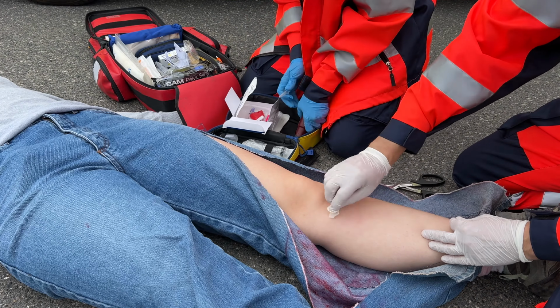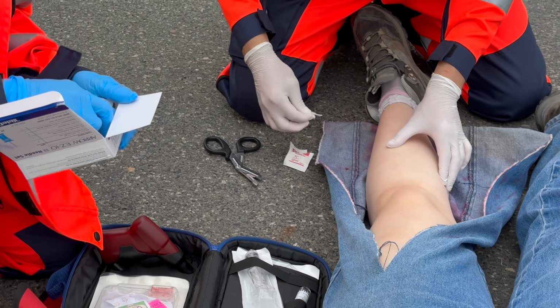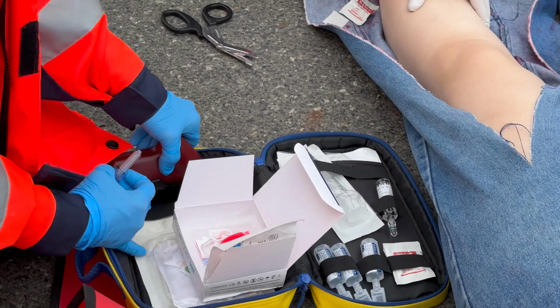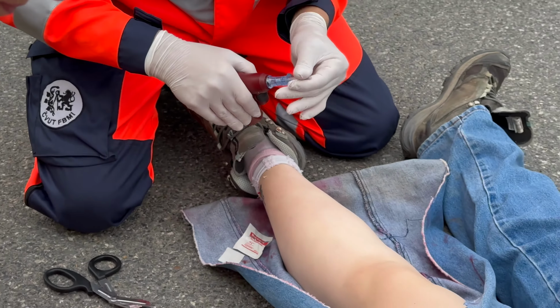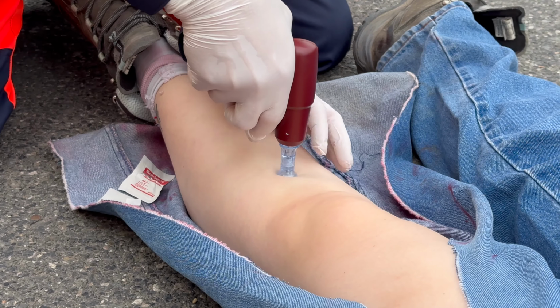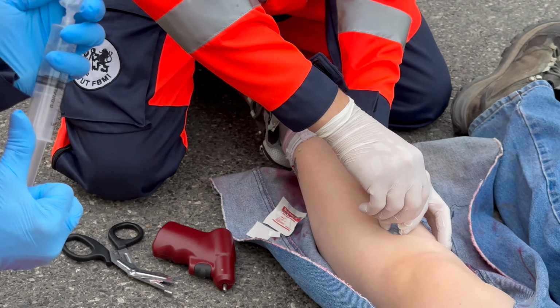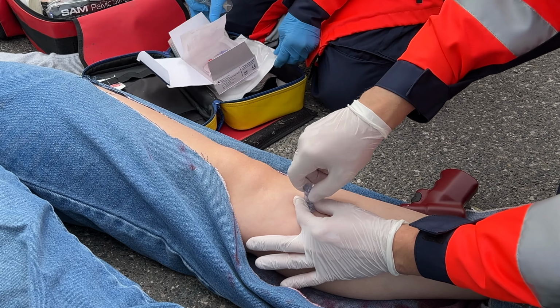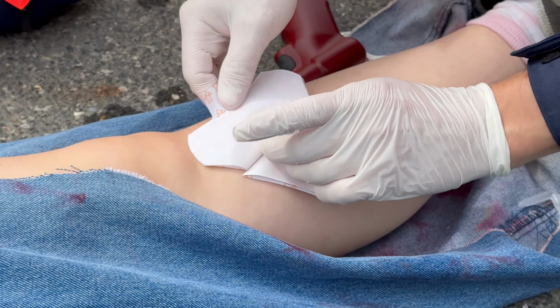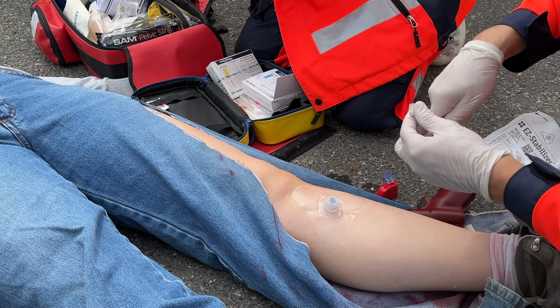After mechanically cleaning and disinfecting the puncture site, the skin must first be punctured down to the bone, where resistance can be felt. Once the needle is in place, pressing a button activates the drill, and with gentle pressure, it is pushed into the bone. Drilling must be stopped upon loss of resistance. The needle must be inserted so that at least one marking is visible. The drill is removed, then the introducer stylet is taken out of the needle and disposed of in a sharps container. The needle is secured using a special fixation adhesive, and the pre-flushed connecting tube is attached to it.